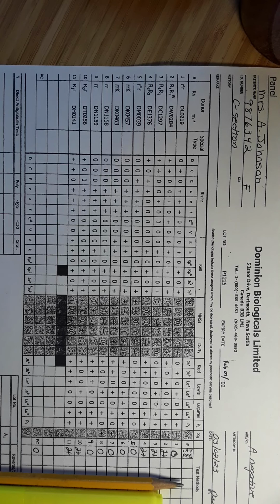So you'll see cells 1 through 11 have been set up. What they did there is set up 11 test tubes and put 2 drops of plasma in each test tube. And then to each test tube, they added 1 drop of the appropriate panel cell, 2 drops of PEG, and proceeded with the IAT antibody ID.